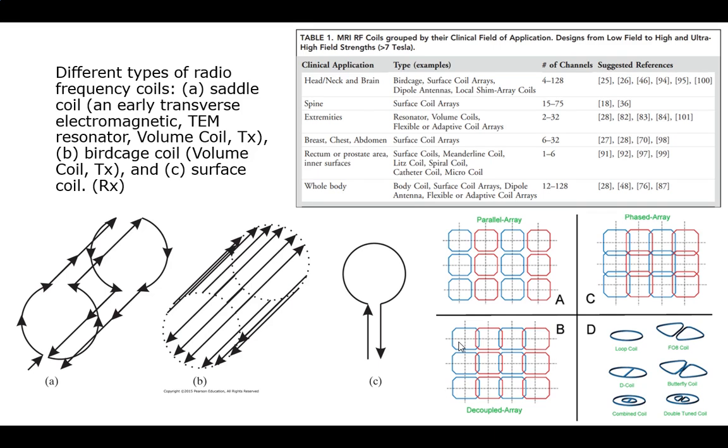And the signals you're actually measuring now are tiny, right? So if there's any amount of crosstalk, we're going to do a lot on the circuit to try to avoid it. But one of the things we can do is just make multiple copies and walk through different sections of them, so I have ones that aren't on, so any induction across them doesn't cause a problem. But yeah, no, it's not a problem in your body.